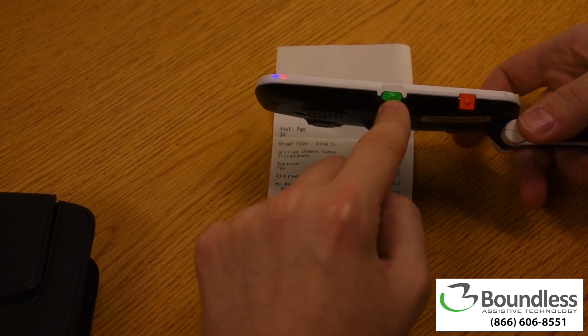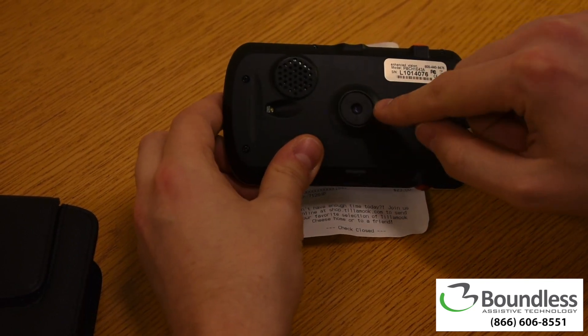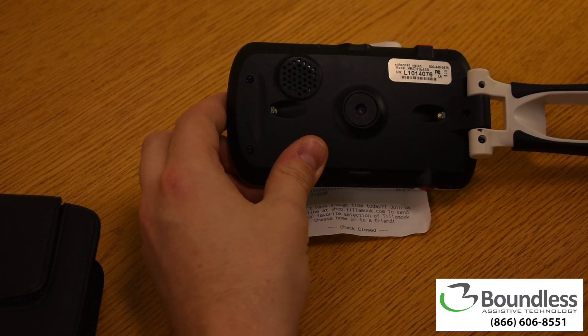The power button is also centrally located. On the back, we have a centrally located camera in addition to LED lights so we can read no matter how dark or bright the situation may be around us.